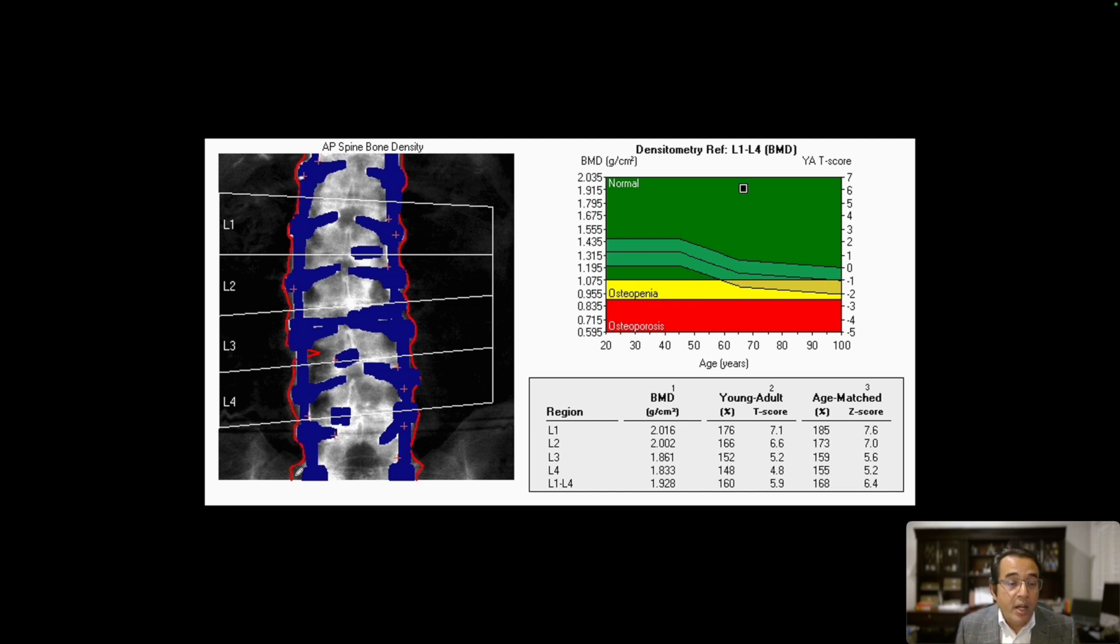This is not advisable because with this amount of hardware, we don't want to process the lumbar spine or report the numbers generated from that processing. You can see here that the bone mineral density is very high and the T scores are very high.